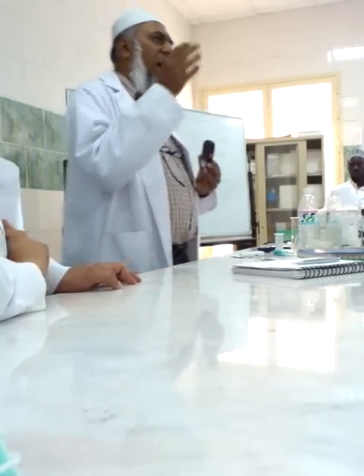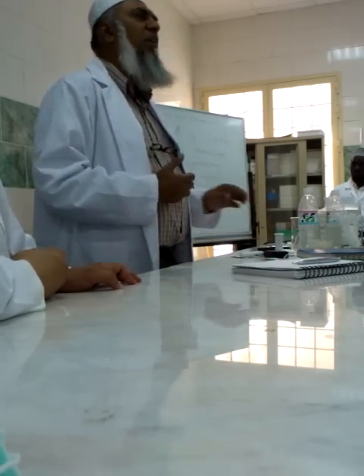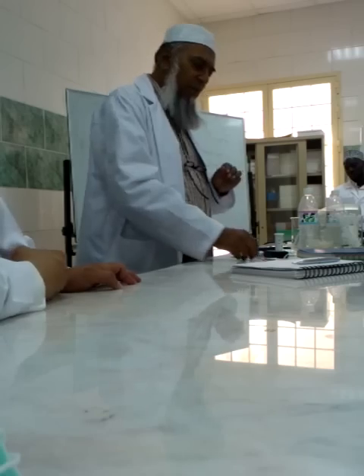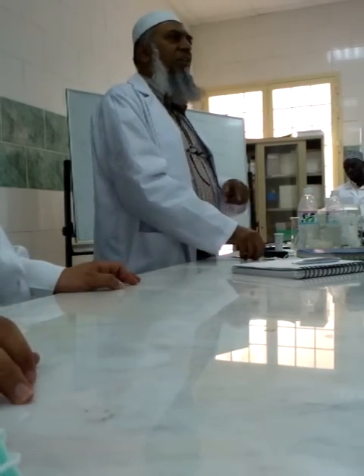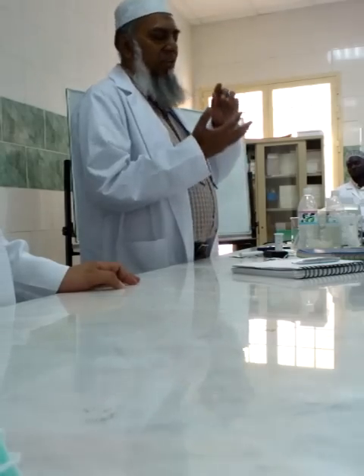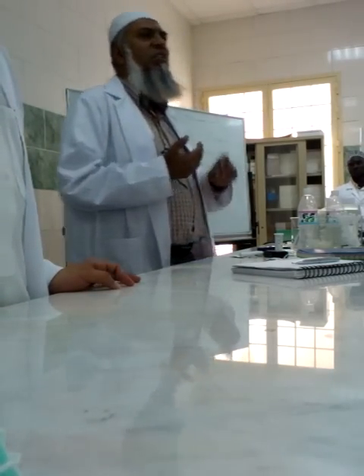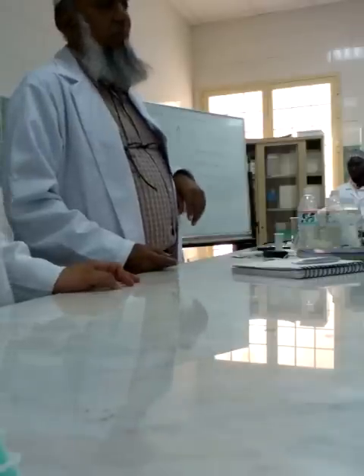But after exercise, if it is decreasing, why is it not giving a decrease? So it means that one possibility is not in the instrument. The possibility may be that the exercise that we perform is not enough.